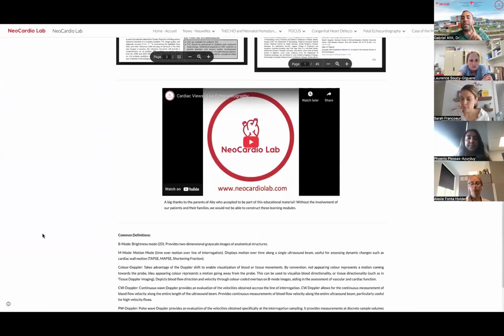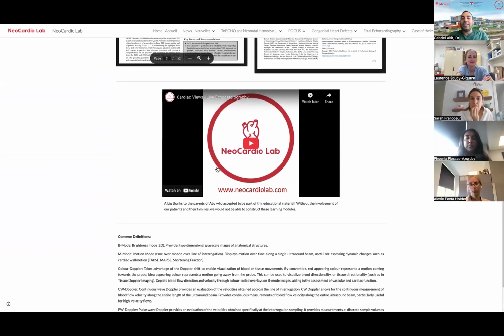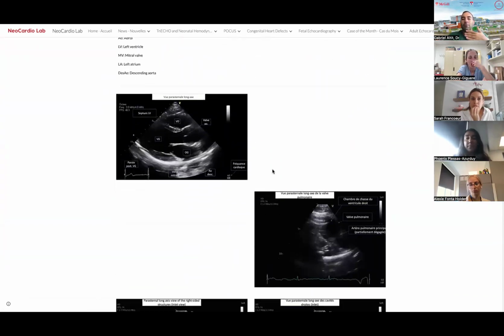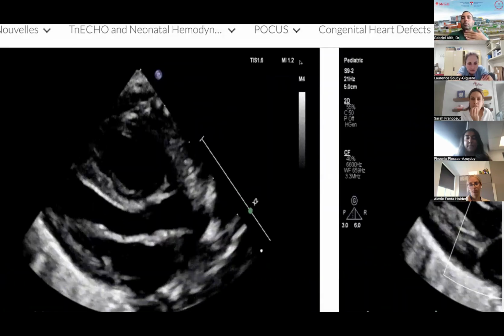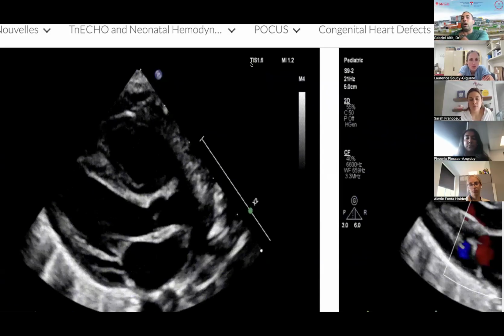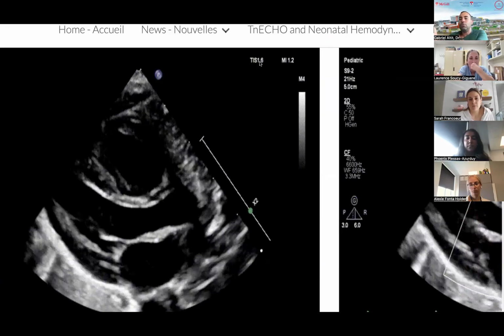Beware, because this is not radiation. It's not the same thing as the ionizing radiation we use for X-rays or CT scans. So if there's ever a quiz that asks whether there's minimal or not minimal radiation in ultrasound, there's not minimal radiation, there's just no radiation, just so you're aware. There's none. What it does have is some kind of energy dispersion. So you often get on the screen some information about the mechanical energy you're transmitting, and often these parameters are bound by guidelines established for the safety of humans.